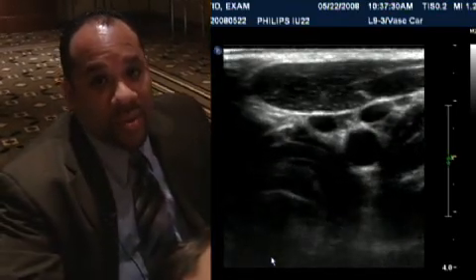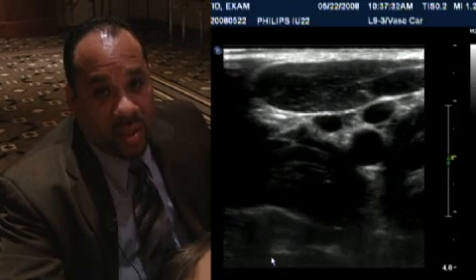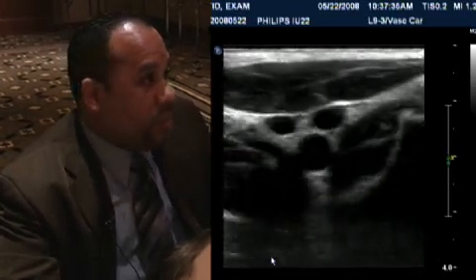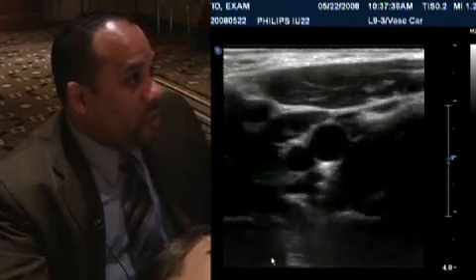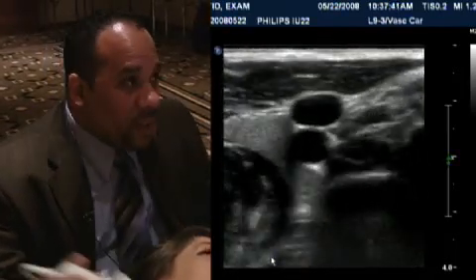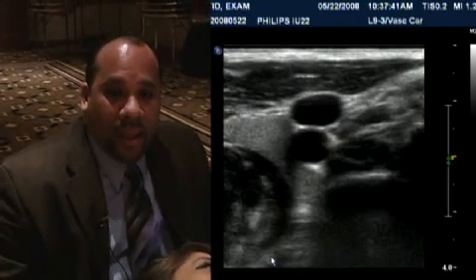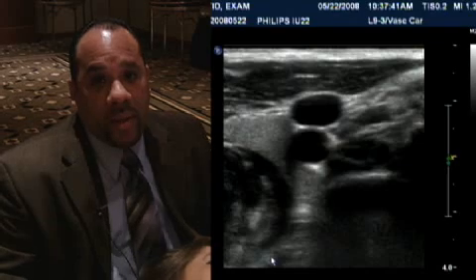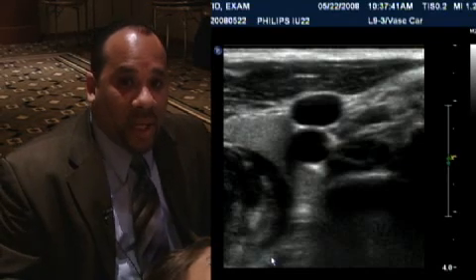Within the first 30 seconds or so of the beginning of the examination, you pretty much have a good idea about how long it will take and how difficult the examination will be. So it's a good idea to start off every examination with a nice transverse sweep of the carotid artery system. So I've demonstrated the techniques that you can use to evaluate the carotid arteries. Of course, you would repeat the same steps on the contralateral side.